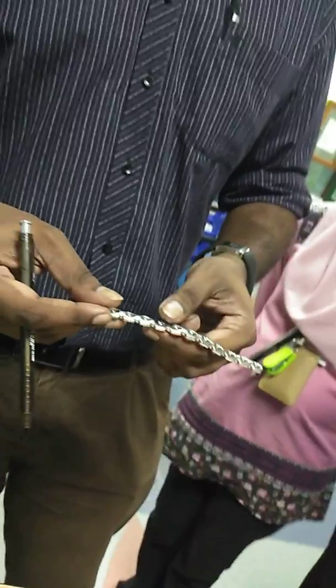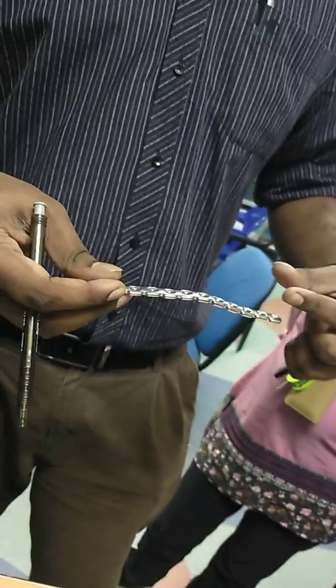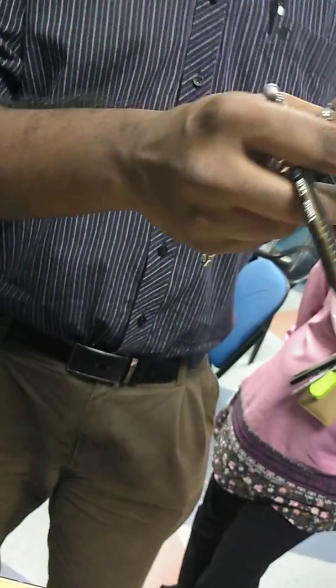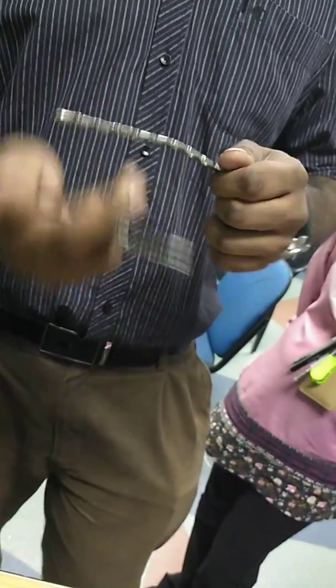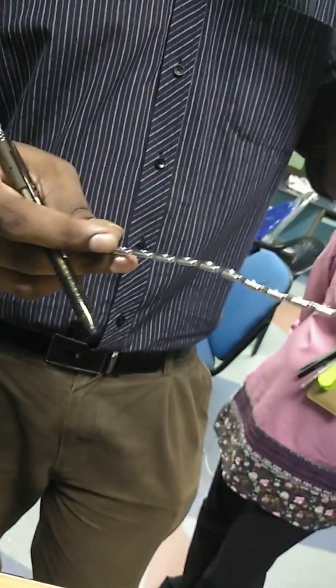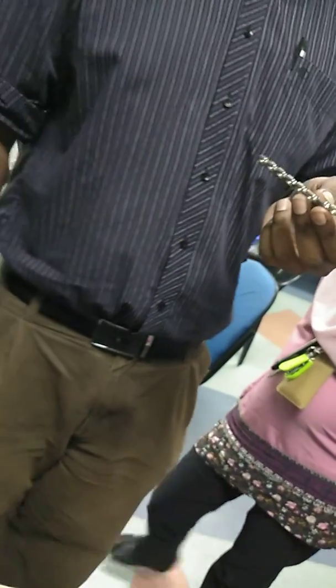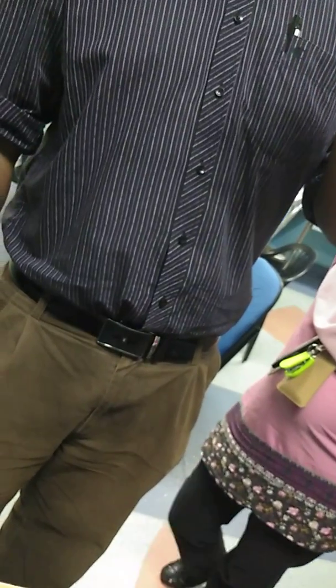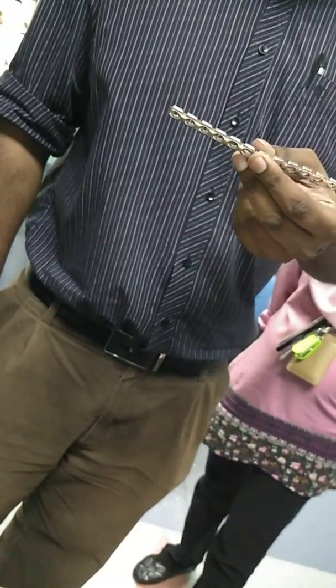When you open a recon plate, there'll be a template also, which is not made out of stainless steel but out of plastic. It follows the shape of the recon plate, same size. You place it on the bone first to see how the bone goes, and then you use that as a guide to bend the plate into that shape, so you can place it on the bone. Mostly we use it for bones with irregular bony architecture like the pelvis, clavicle, right? So this comes under neutralizing plate.